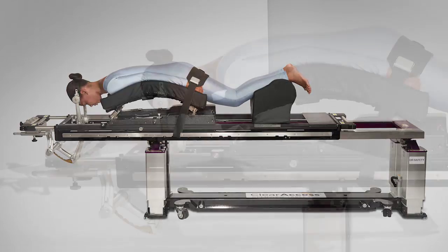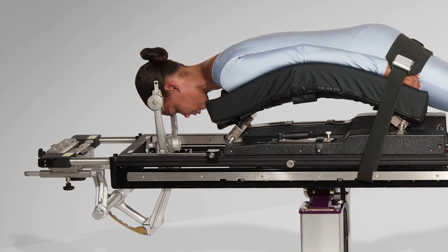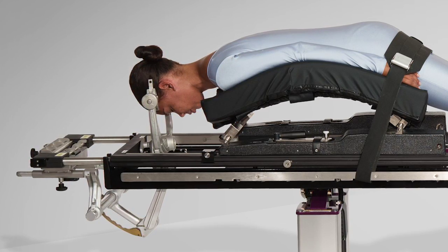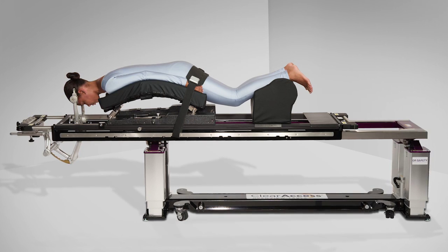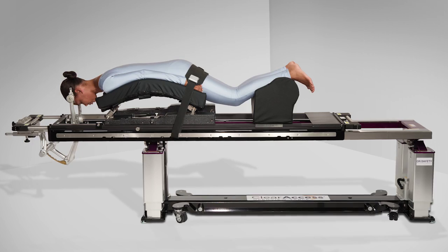This video details the correct setup of the Clear Access table for posterior cervical cases with cranial stabilization via a Mayfield skull clamp. Note that the table may be configured with the OR Safety 4 poster frame, called the open frame, or the FlexFrame, OR Safety's version of a Wilson frame. In this video, we will illustrate the installation and use of the FlexFrame.